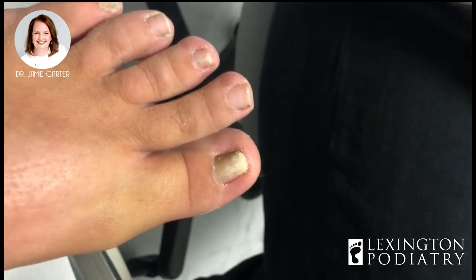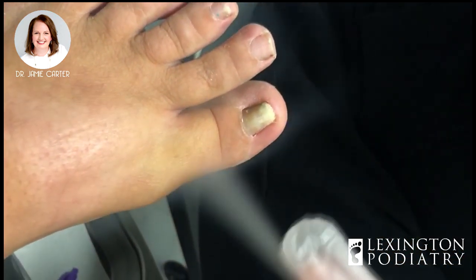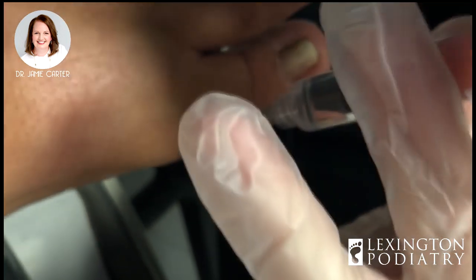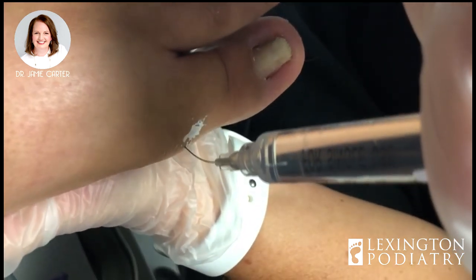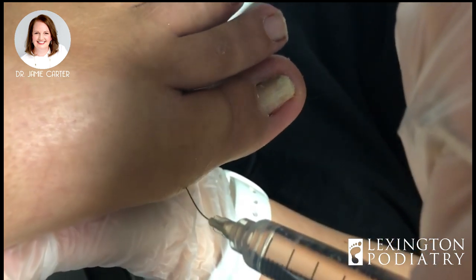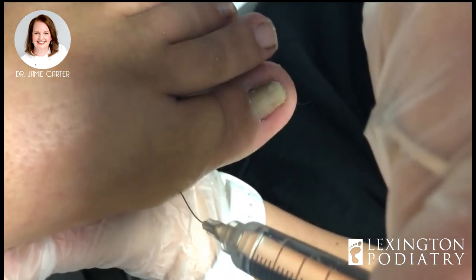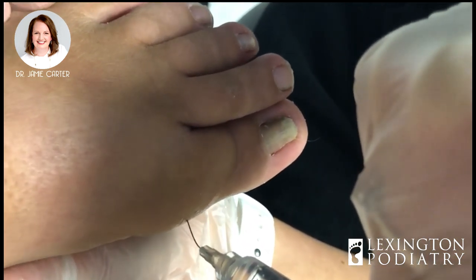Are you allergic to any numbing medicines? Not steroids? Okay. Let's spray some cold stuff on your skin — you get two little pokes. Super super cold. Okay, I'm gonna get this toe numb. We normally use about six cc's of numbing medication, sometimes a little more, sometimes a little less. We definitely don't want to use epinephrine in the toe, which can constrict the blood vessels. Doing okay? I know it hurts.